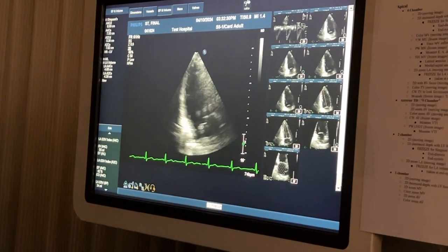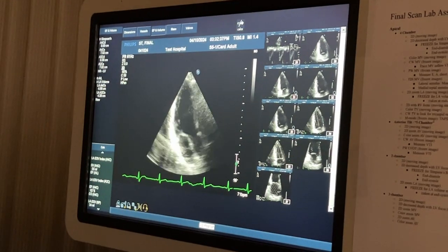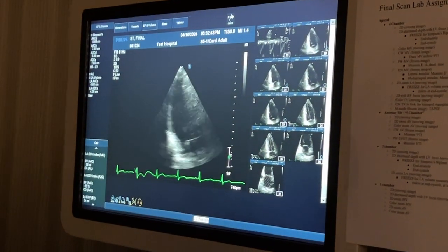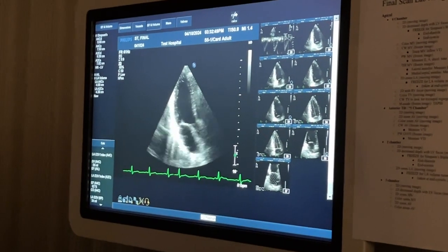So just a little rotation until you start to open up that aortic valve, and it's gonna kind of look like a reversed or twisted parasternal long axis. Maybe come forward just a tiny bit more. I love that. That's great. Yep, I just kept twisting in the same direction of 2-chamber.